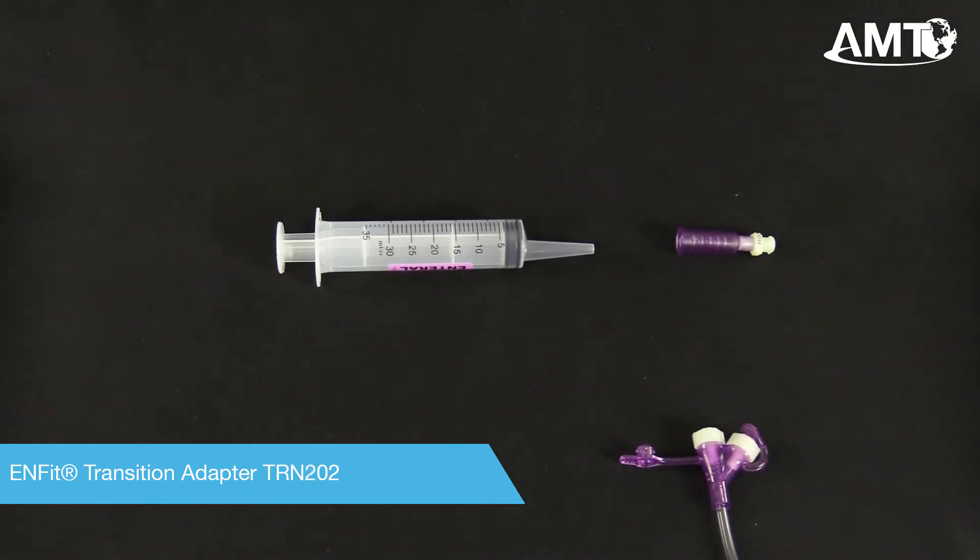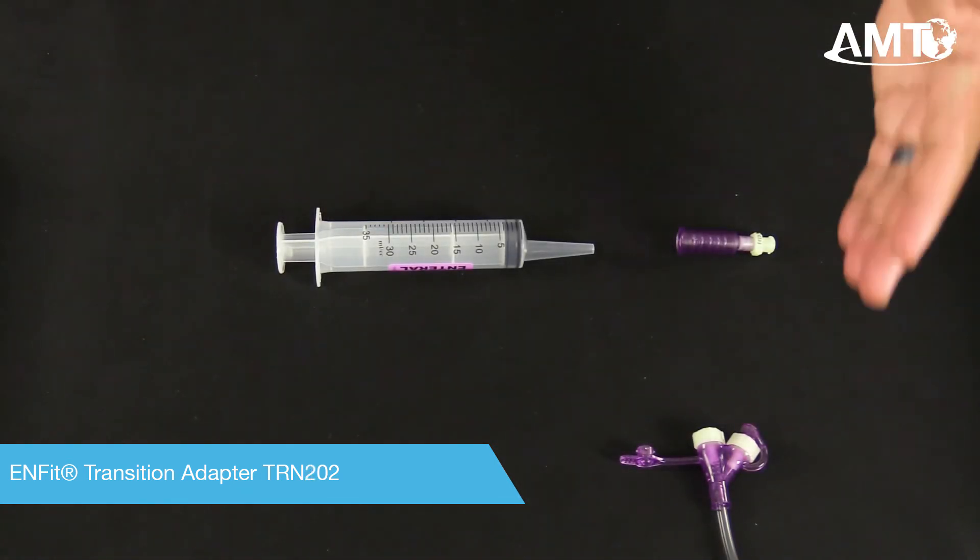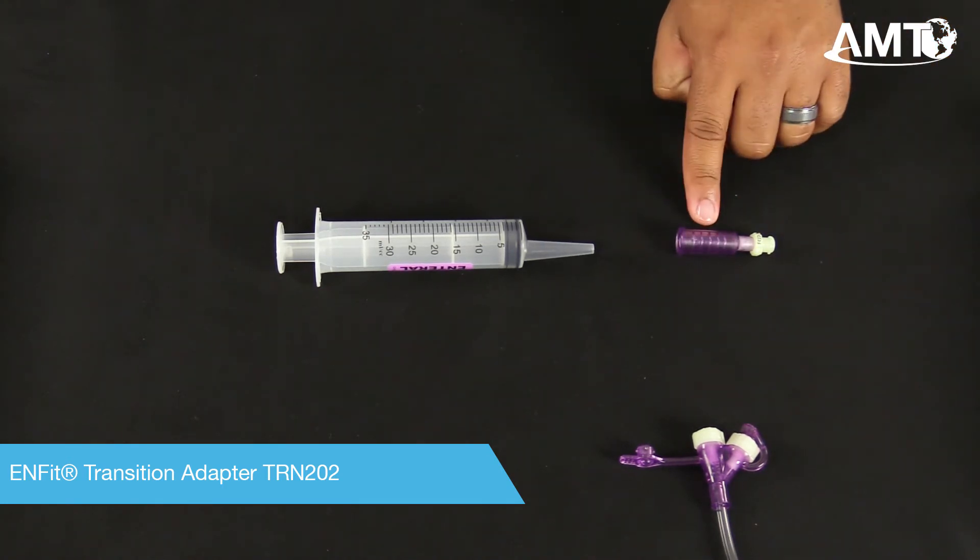If you have a large catheter-tip syringe but an InFit feed set, simply attach TRN-202.